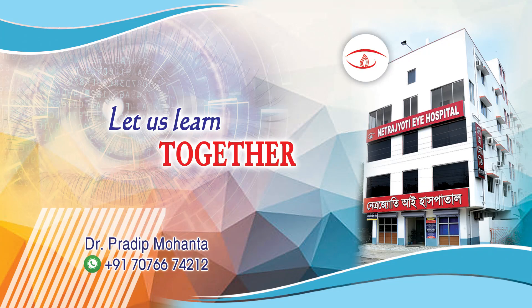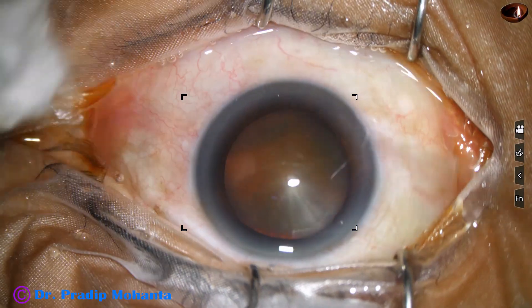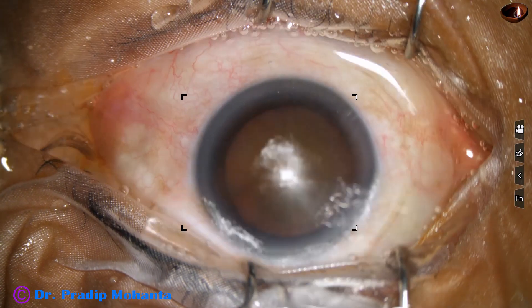Dear colleagues, welcome to my workplace at Rana Ghat, East Bengal, India. This is a cataract with grade 5 nuclear sclerosis. Let us observe this surgery.